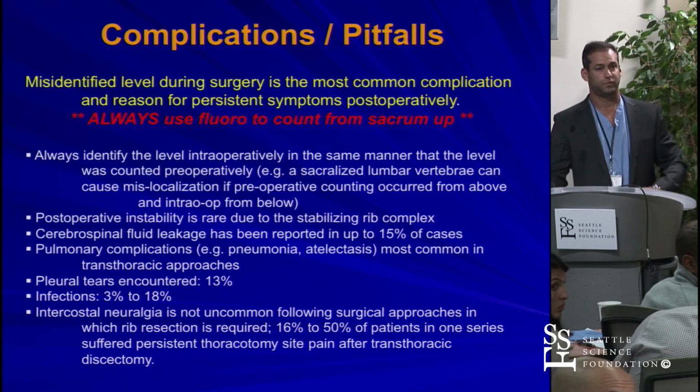The other thing that I do is, very often patients who have thoracic disc herniations often have anterior osteophytes, so those are very often visible, and so I just check for individual characteristics of the osteophytes that are either above or below the area of interest, and use that as a reference point. Yeah, that's a great point, Paul.